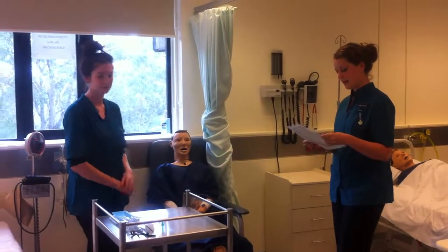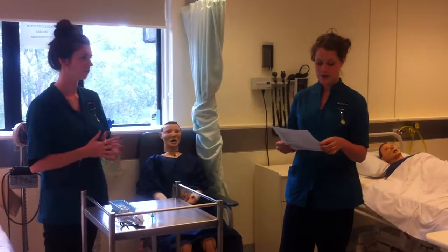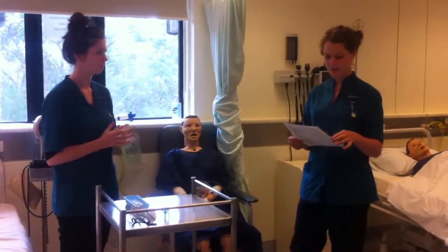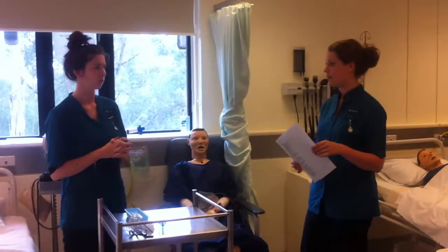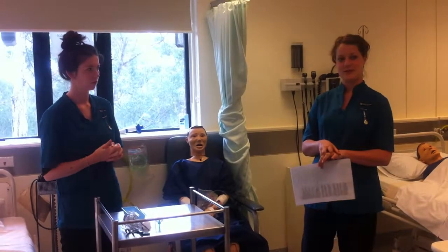Alright, so the nebulizer will be changed every 3 days, or if it becomes contaminated with sputum, or if it's not working. This is to ensure clean functioning equipment is available. And always make sure that the patient is educated well.